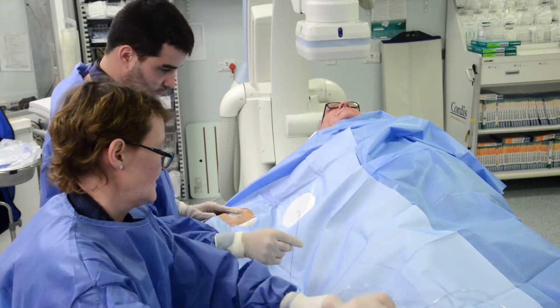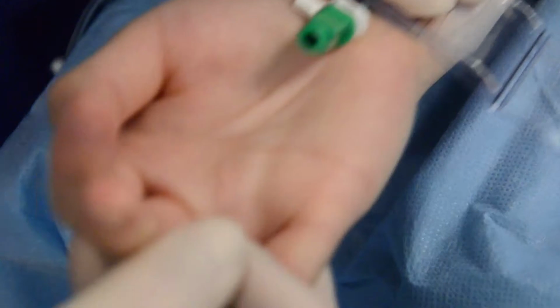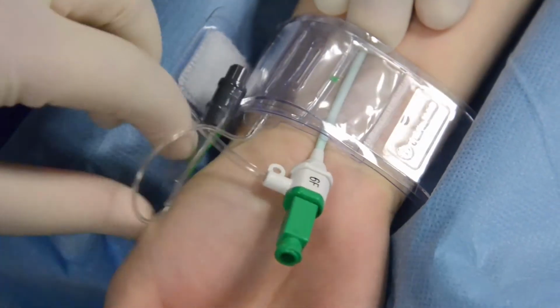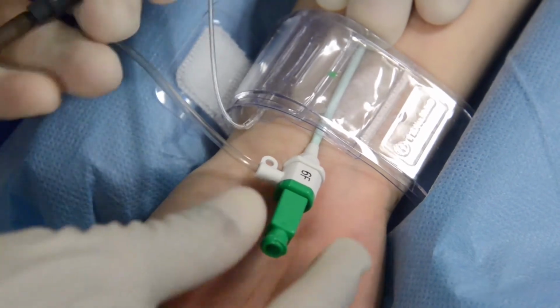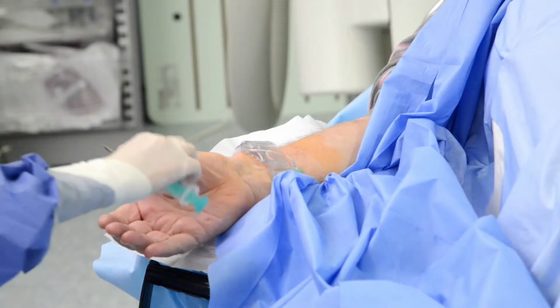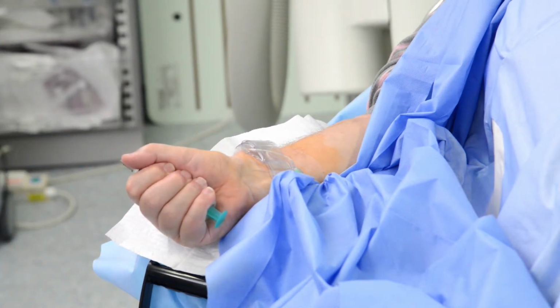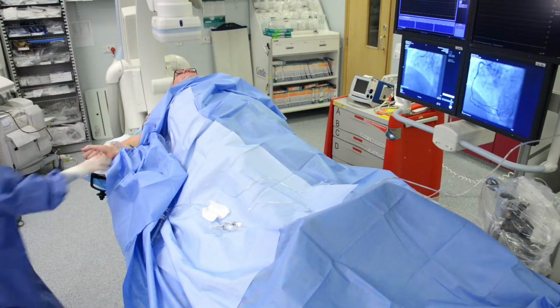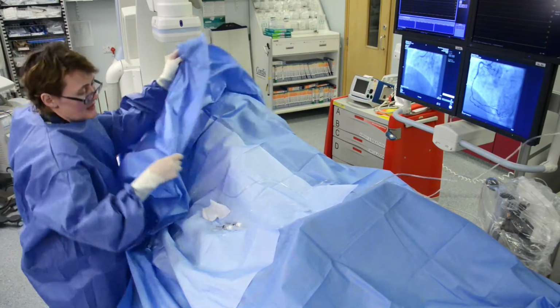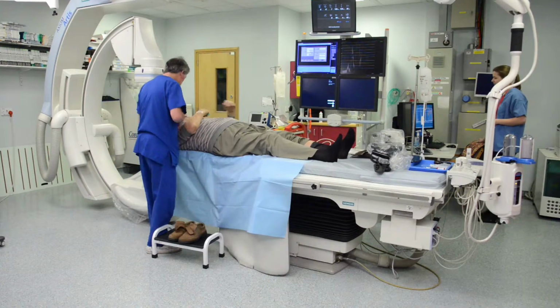If the procedure was through your wrist, a special pressure band is applied, which is slowly released by ward staff on your return to the ward. If the catheter was inserted in your groin, a special closure device called an angioseal may be used, or you may need the tube removed by the staff on your return to the ward. You will be asked to remain lying flat for a period of time between 30 minutes and 1.5 hours.